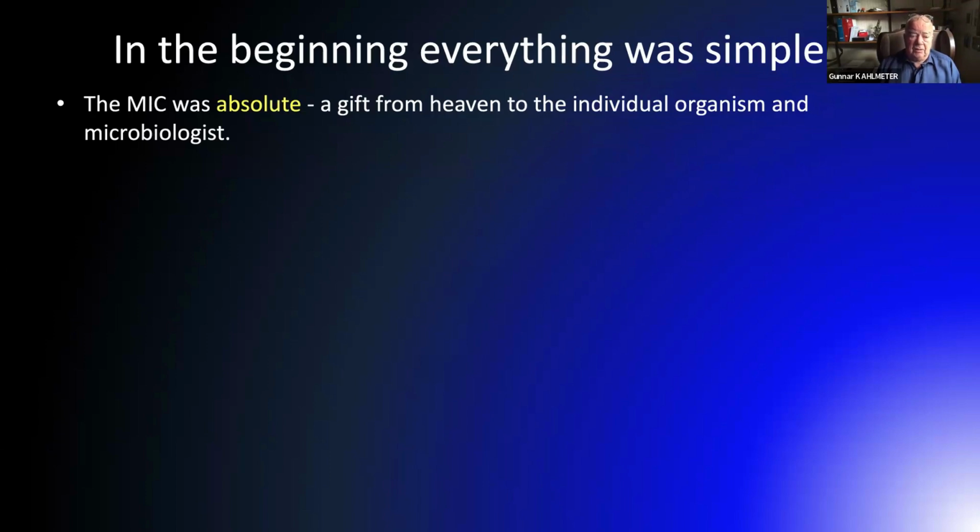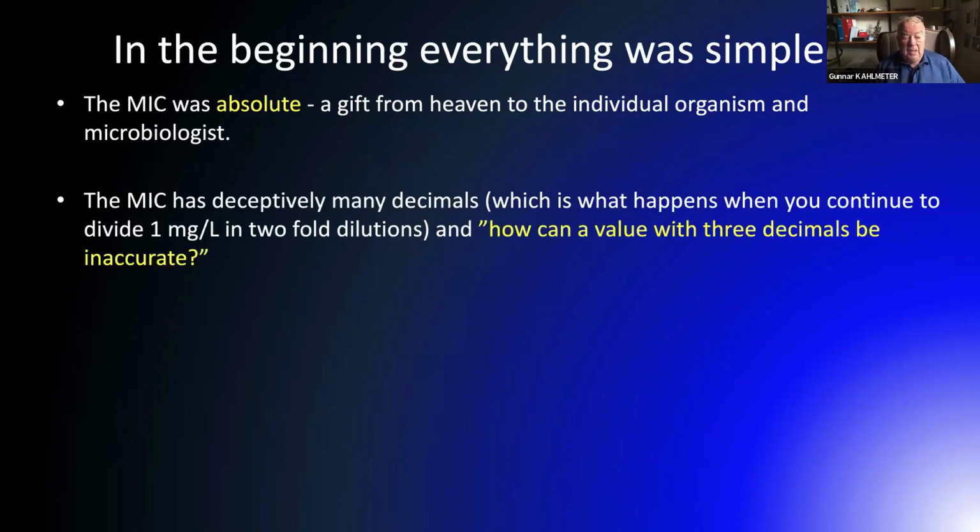You can juggle the MIC any which way you like by changing pH or the medium, calcium content, incubation time, inoculum, etc. So please remember that the MIC is a relative measurement, and it's not something that God or Allah has given to the bacterium, and which is an inherent trait of the microorganism.